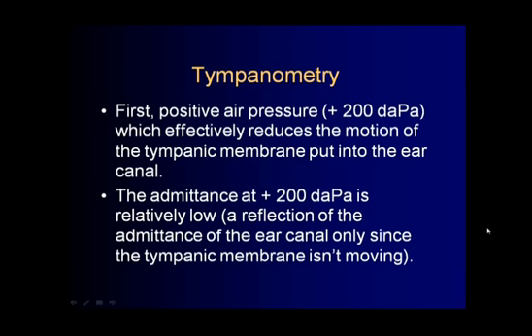Since the eardrum is so stiff, it's not vibrating as well as it normally would under normal conditions. That means that the probe tone is being reflected back, so there's an elevation in probe tone. The equipment will detect this increase in probe tone level. The automatic gain control kicks in and decreases the voltage to the speaker.